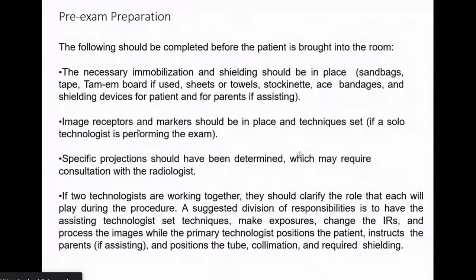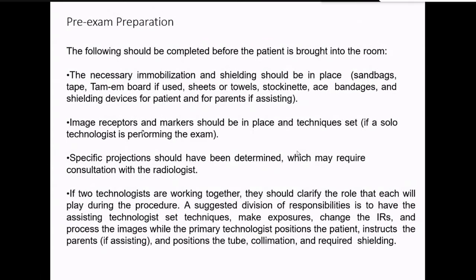And the second radiographer can attend the patient, can be with the patient, position the patient, and can set the X-ray tube, collimation, everything. So he can work on the patient side, and the other radiographer can work on the machine side. So teamwork will be more effective if we are doing pediatric radiography. So is there any kind of technique that we have to pre-plan before bringing the patient into the radiography room?